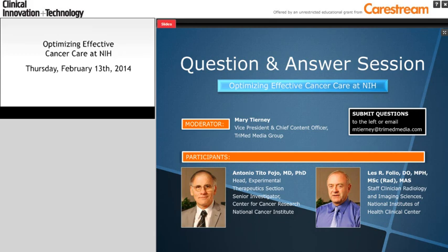But what we have done over the last few years is apply the registration, both global and refined registration, where I believe that's helped oncologists a lot more in referring to images, registering across time, co-registration temporally, and easing the comparing. So that part has been mastered and implemented, and it's easing our work in radiology, and I believe using the oncologist review capability. We're also, I'd like to mention, doing a survey of our oncologists here at NIH, NCI, to see where we stand with the traditional reports, and after we implement this over the next year, more widespread, to then take another survey to see how this improved quantification has helped. That's my perspective. Maybe Dr. Fojo has his perspective on what.